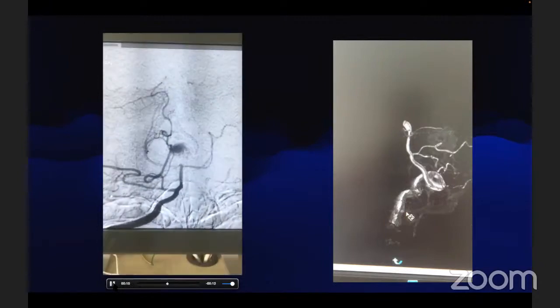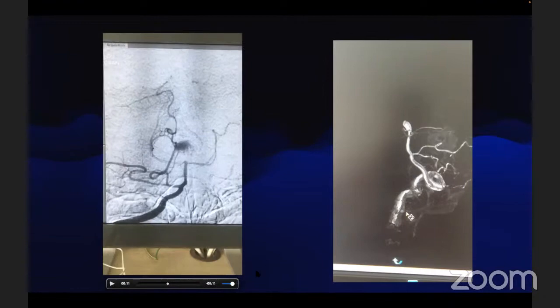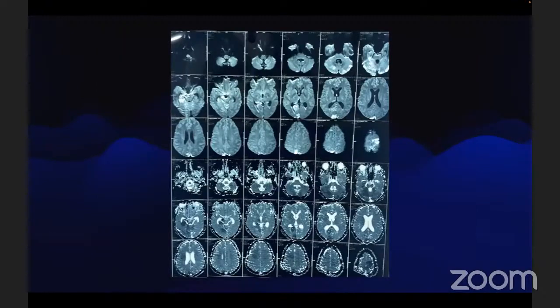The MRI shows a large aneurysm, not partially but almost completely thrombosed. It looks like it ruptured and also threw emboli. Yes, probably, sir. It's more in the occipital lobes.